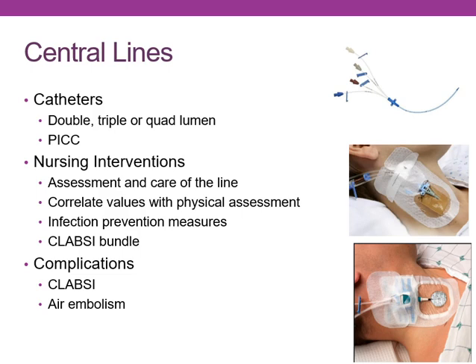Keep it closed, make sure we don't have air in there, and probably the most important thing that we can do is daily assess, do we need this catheter? Because if we don't need it, we need to get it out. And I know at one facility in town that is a nursing job to assess, do they need their Foley, do they need their central line, and if not, we need to get rid of them.